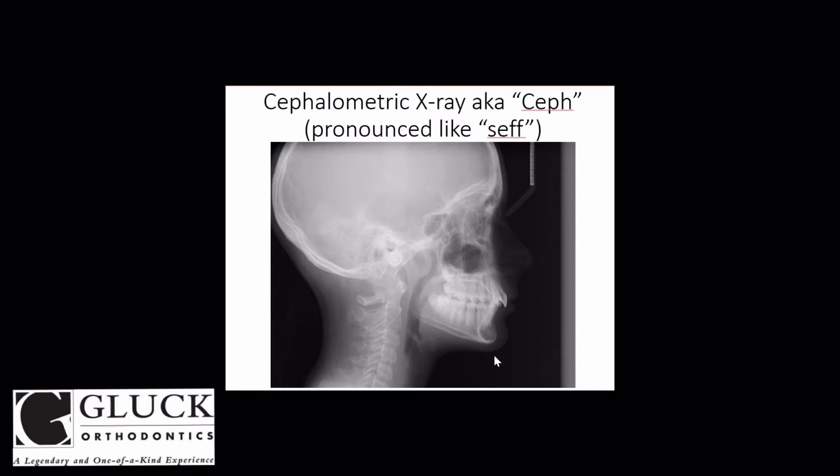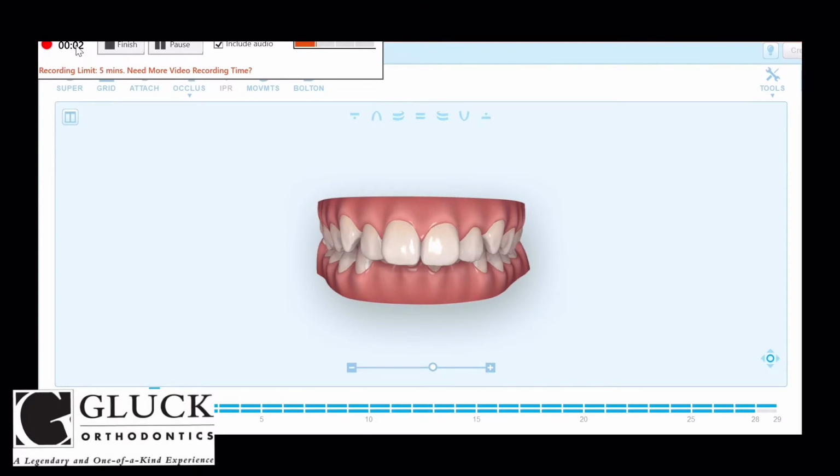Again, all of this is combined with the other data that we've gathered from the panoramic X-ray, the clinical photographs, and the clinical examination to formulate a complete diagnosis before we move into developing treatment options and a final treatment plan. Okay, here we go. So we decided to treat this case with Invisalign. What you're looking at is a screenshot of Invisalign software, which we call ClinCheck.